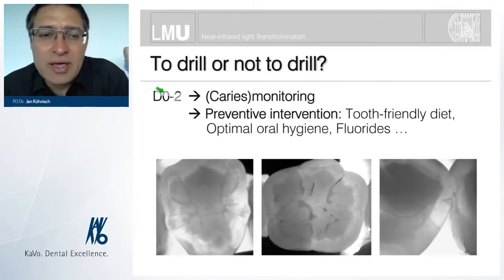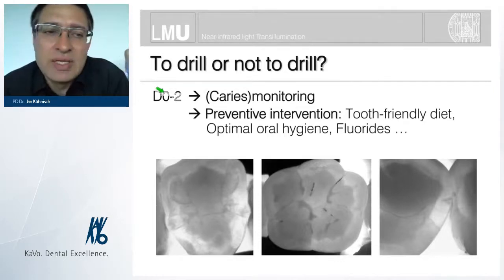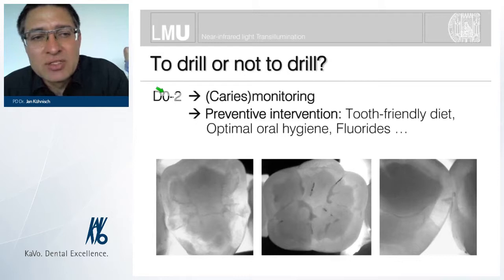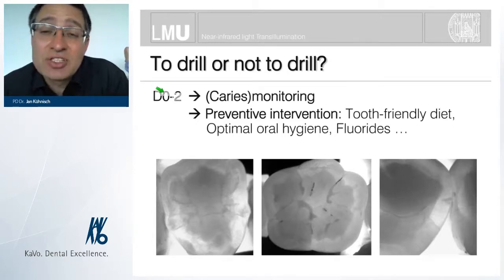We are definitely happy today that we have a lot of healthy patients which do not need any additional diagnostic methods maybe, and we can monitor them and see what is going on. If the risk is changing, which we can see clearly with the presence of non-cavitated caries lesions on smooth surfaces maybe, then we should bring additional diagnostic methods to the attention of these patients.